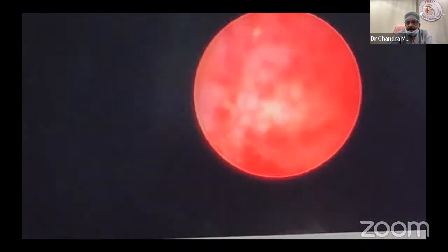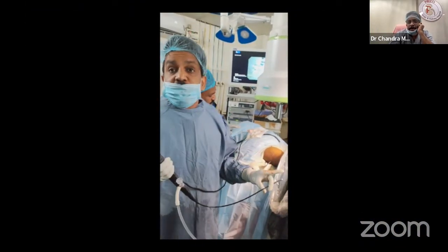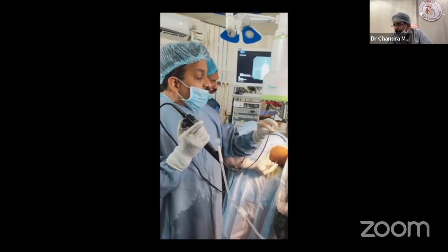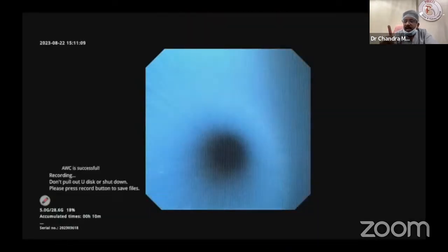Now in this we can use the flexible. I am showing how each calyx can be inspected. If the ureter is tight, ECIRS cannot be done. Then the flexible scope can be used. Flexible nephroscope. How the flexible? See, now the debate is, if you have a stone in another calyx, you don't want to puncture. What are the two options? ECIRS is flexible ureteroscopy from below. If you are in prone position, can you do that? No. That time the flexible nephroscope is useful.